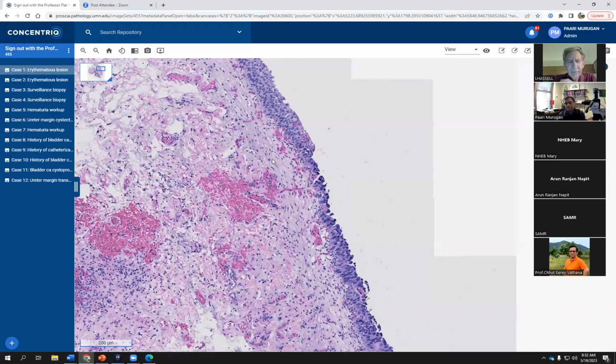As far as P16 is concerned, I really haven't used it in the setting of diagnosing carcinoma in situ in the bladder. I think P16 is often expressed coincidental with the P53 mutation, so in that particular setting where you're wondering, is this null, is this wild type, it can be a valuable internal control, if you will, in some respects. At least I use it that way in the endometrium or the ovary at times. Okay. Thank you. That's a good point.